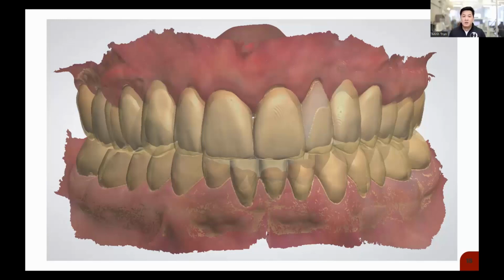But regardless of methodology, whether you're using DSD, 3Shape smile design, CAD smile, or whatever you may be using, the whole point is you want to get all this data together, funnel it down, and distill it into the next step, which is getting to the patient mock-up and then proceeding to either a provisional or going straight to product.